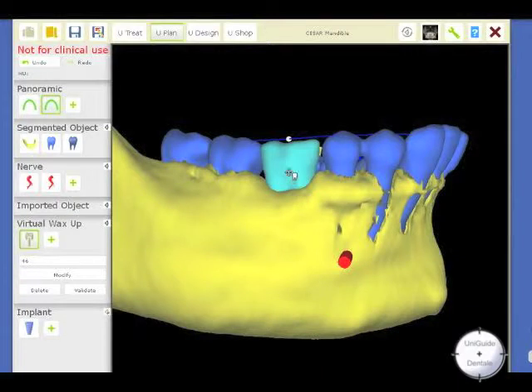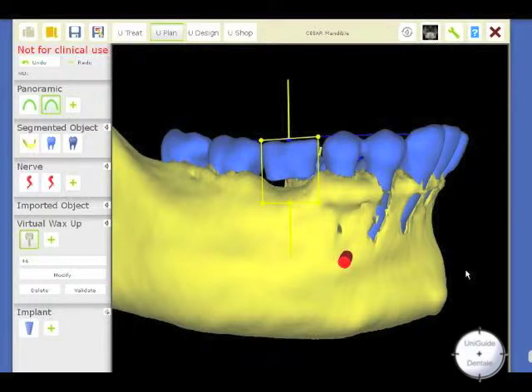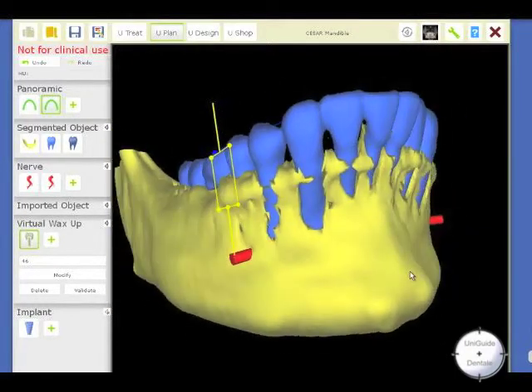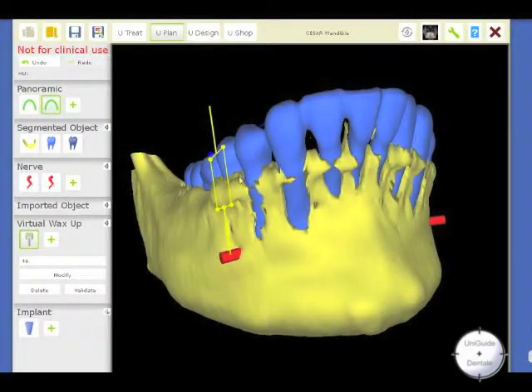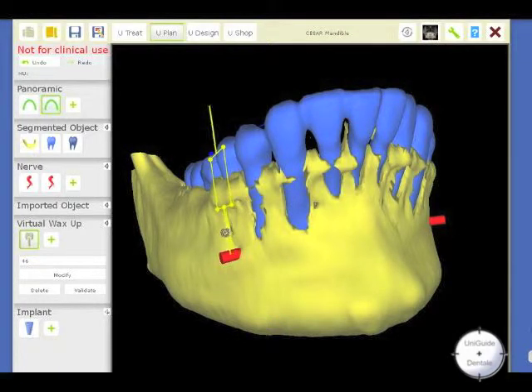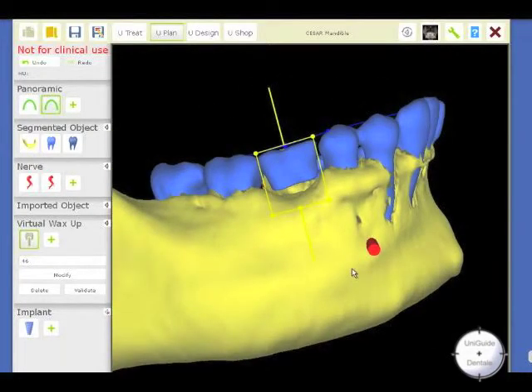This is the tooth. You can change the height. You can also change the angulation. This is not really necessary at the level of the molar, but it will be necessary when you are dealing with anterior, upper or lower teeth.